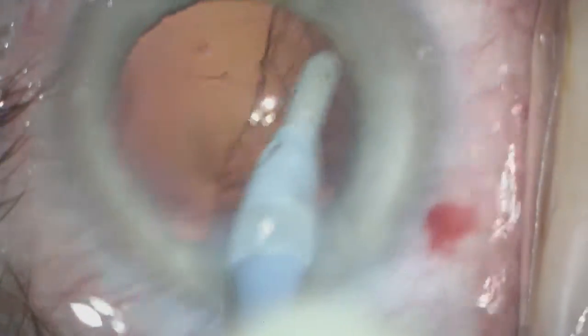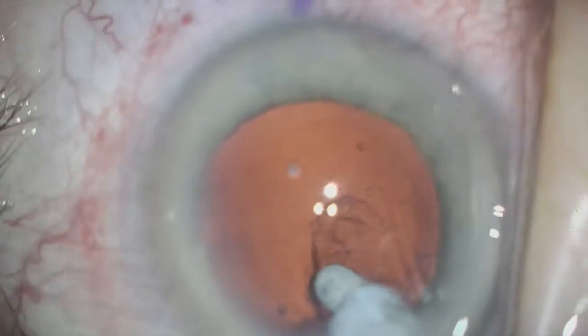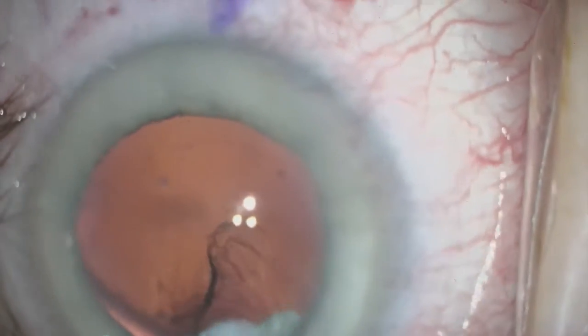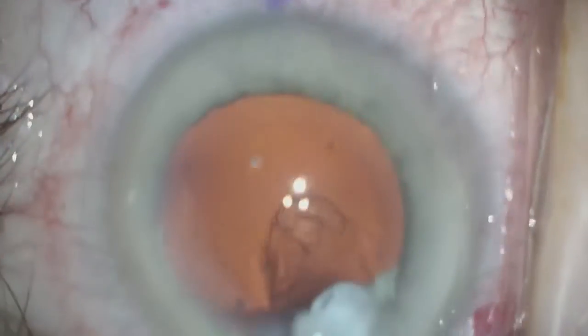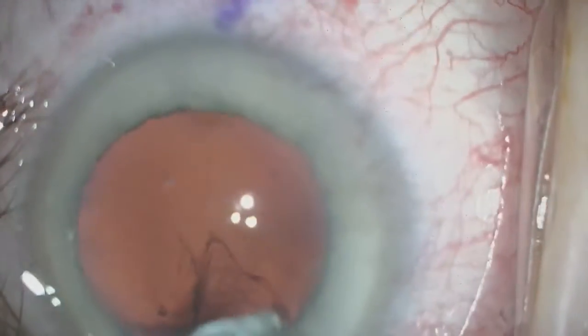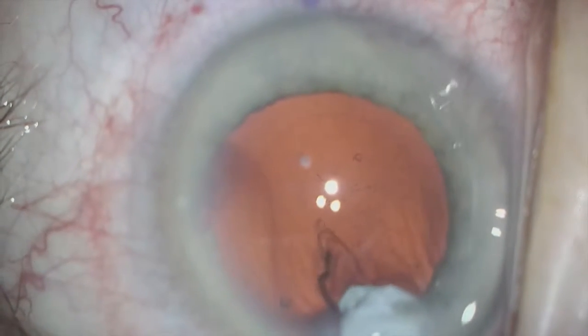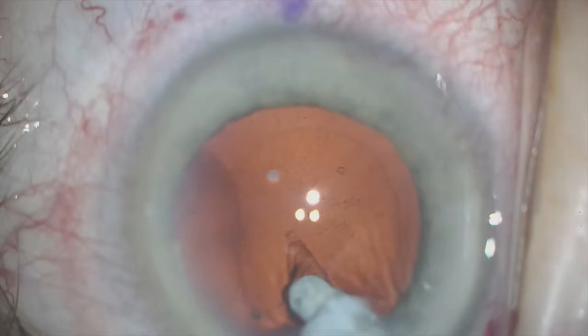As we do this, the small fragment of lens is slowly floating more subincisionally. You can still kind of see it in the video if you look closely. This patient did very well. We ended up putting a multifocal lens into the intact capsule, and in the postoperative period his surgery was uneventful.